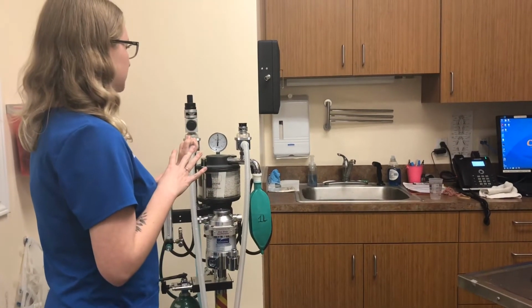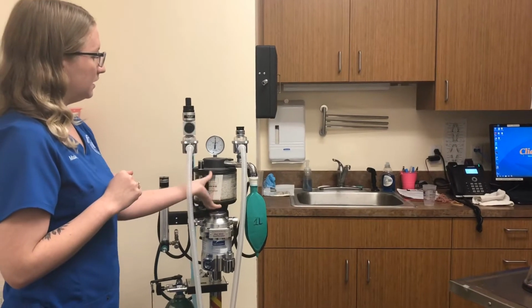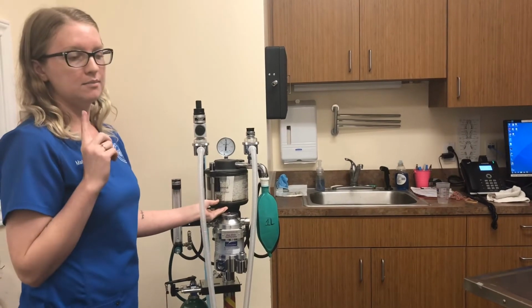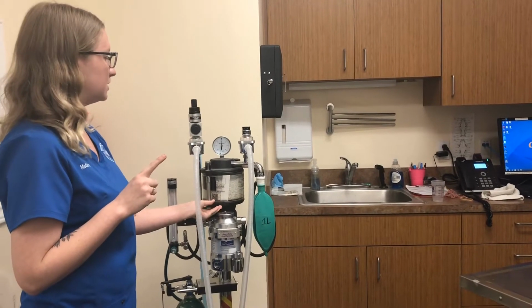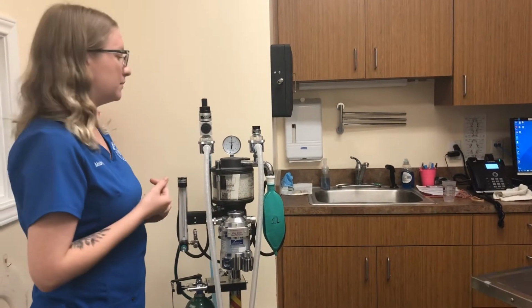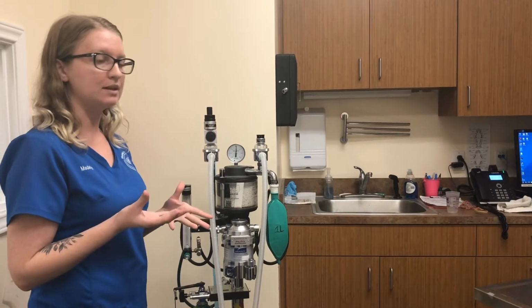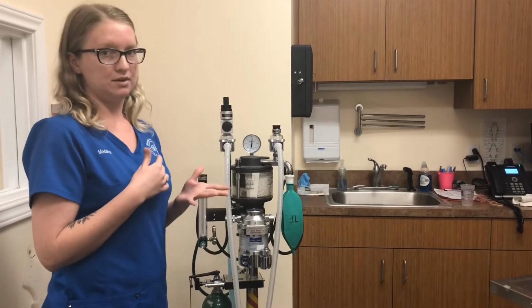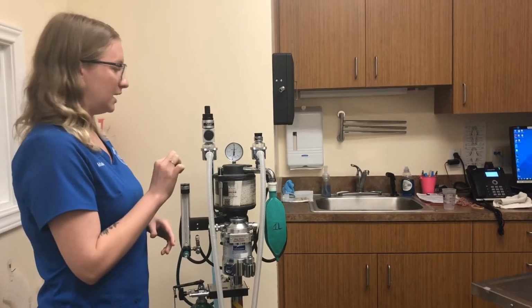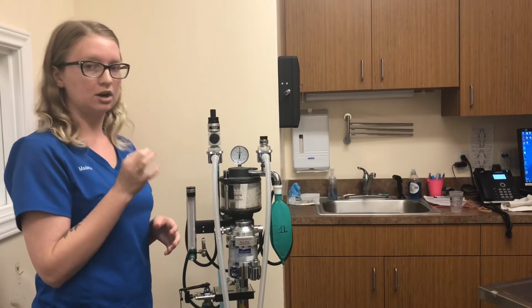Since this is a rebreathing machine, it recycles our CO2, and so we have a CO2 canister here. It will absorb the CO2 and it'll do one of two things. A color change will take place. It's white right now, but it'll turn to a lavender color if it's exhausted. But you want to be careful because if you don't watch the color change happen, it can go back to white without you realizing it. Another way to determine if it's been exhausted is by crushing it. If it's crushable, then that means it's still good, but if it's like a rock hard pellet, then that means it's been exhausted.